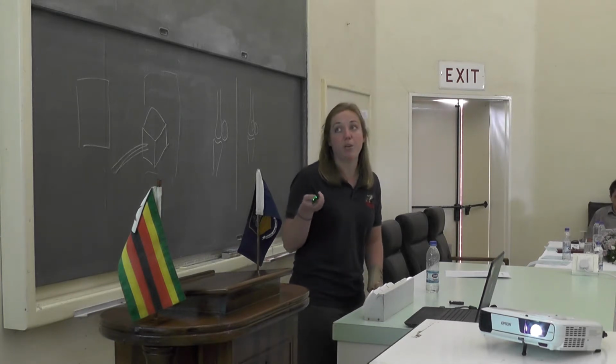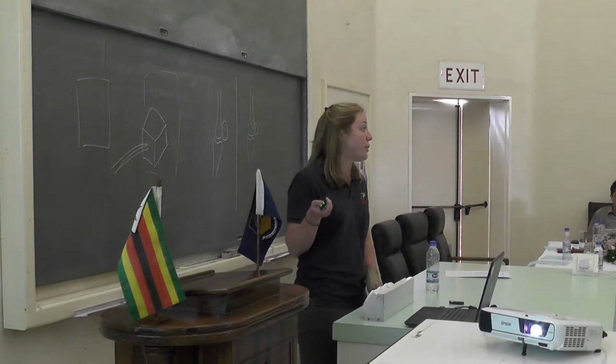Another one of the routine series of the foot would be the dorsoplantar or dorsopalmar view. It just depends on whether we're talking about a forelimb or a hind limb.